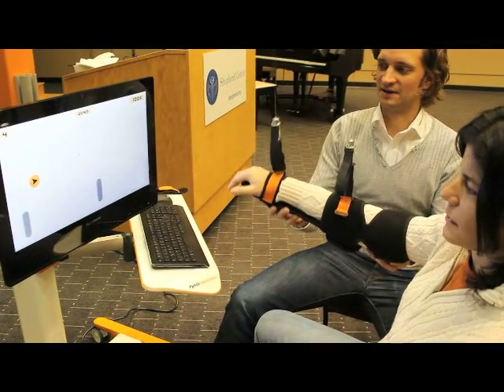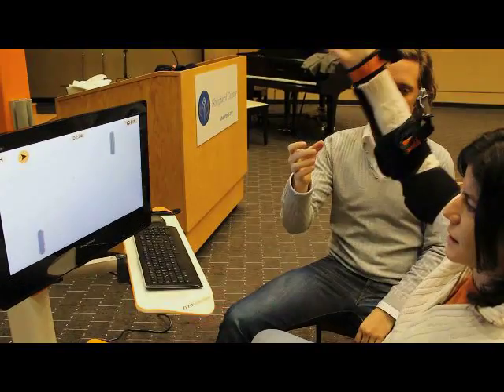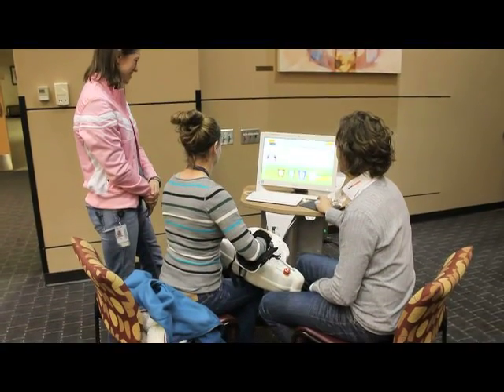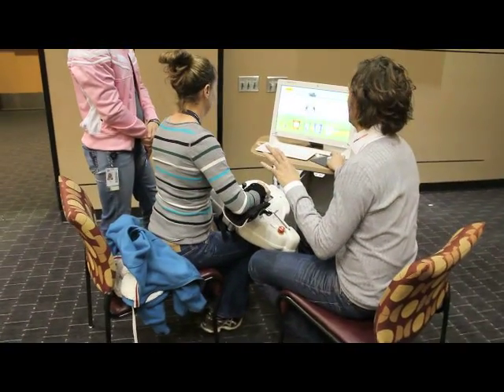You see, if you get outside of the range of motion, you will not be supported anymore. You want to get a smiley face — actually, we didn't finish one of the games. In the end you get a smiley face and you know how well you have done.